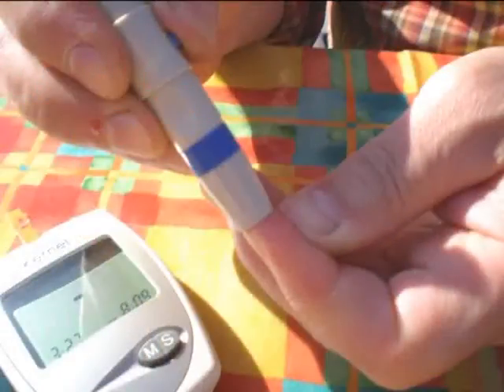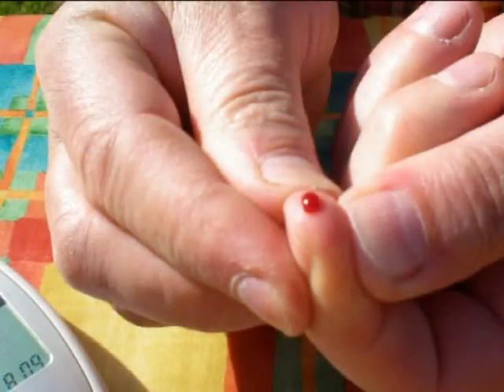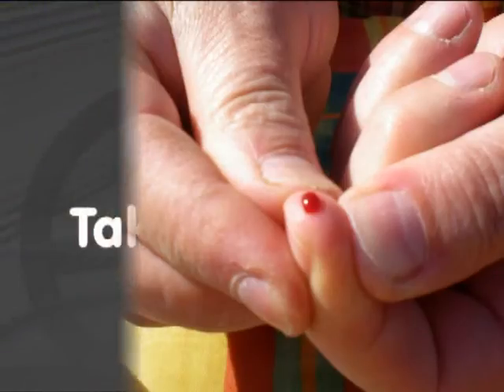Put the end of the lancing device on the tip of your finger and push down. Then press the blue button to release the point. Once you have done this, squeeze your finger until you've got a sizable dollop of blood. We have discovered that the important thing for this test is that you must get enough blood in. If you don't, you may get false readings.